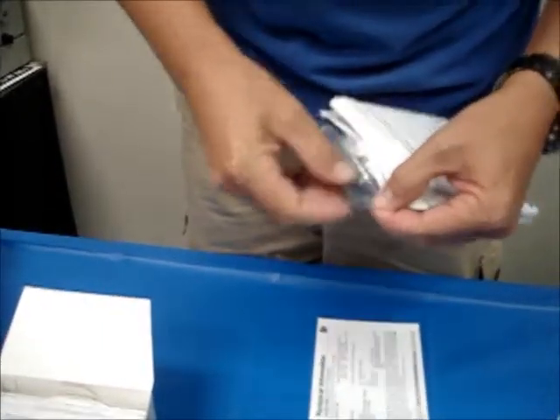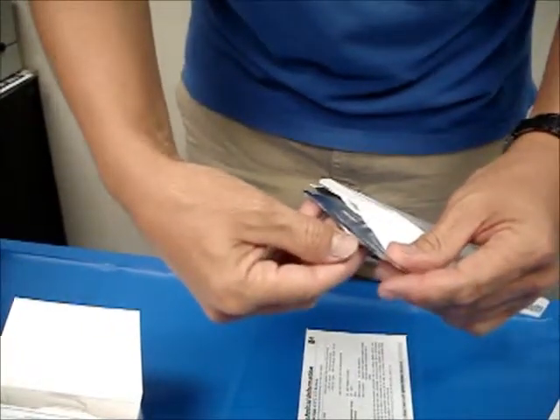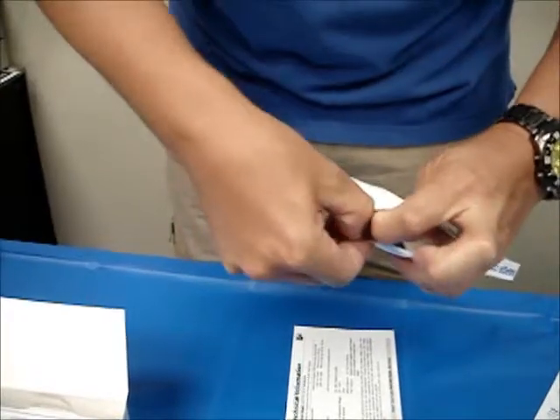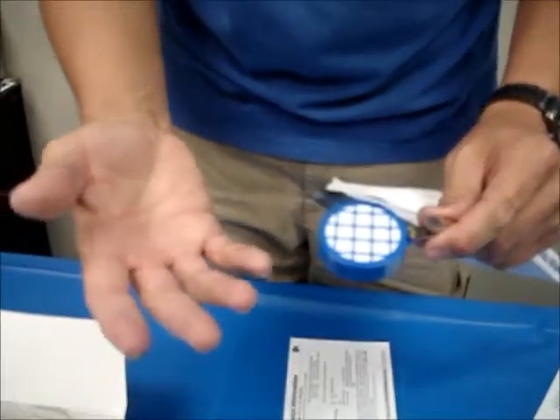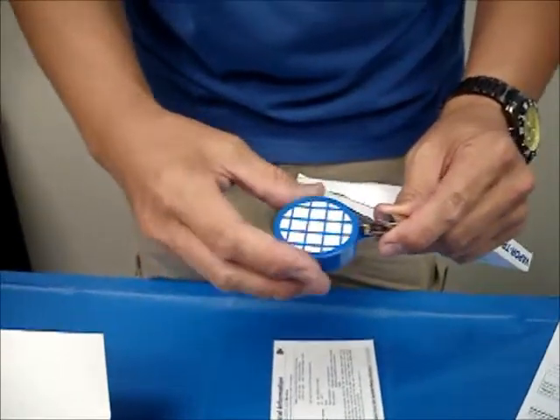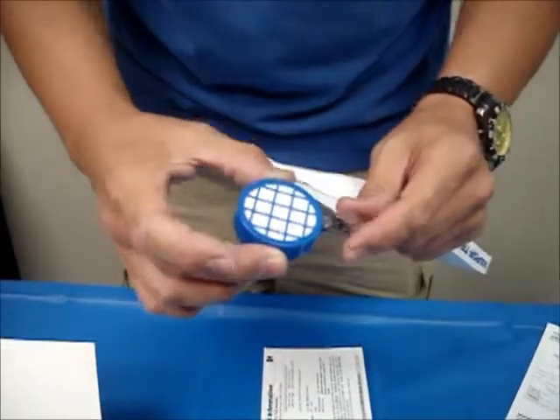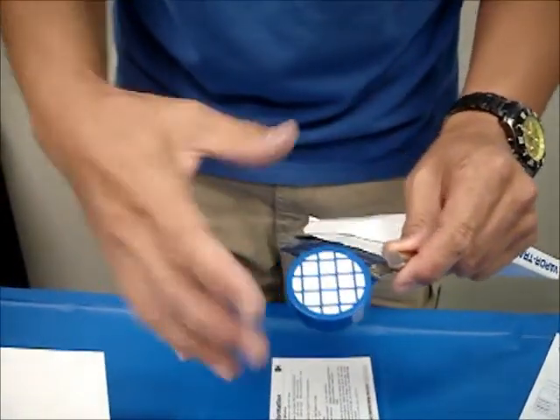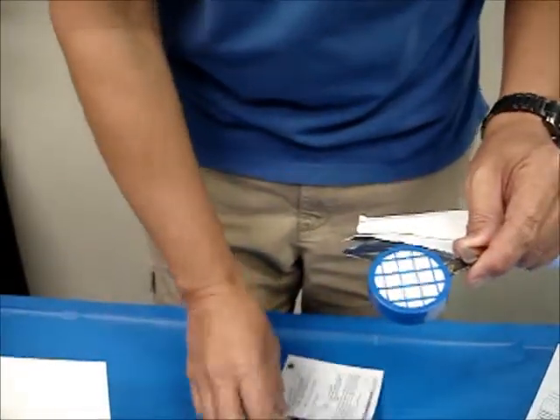We're going to break open the inner foil pouch and remove the badge. Make sure that your hands don't have any residual chemicals on them while you're handling the badge, whether it be when you first take the badges out or put it back in, because any residual chemicals that you might smear or splash on the badge is obviously going to skew the numbers and it's not going to be accurate.